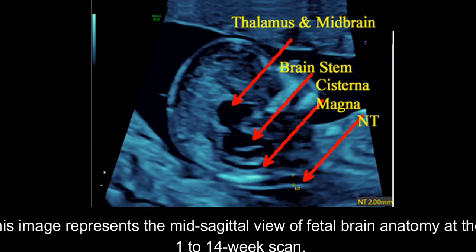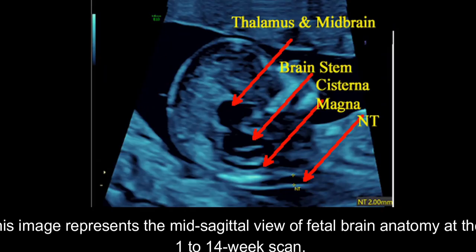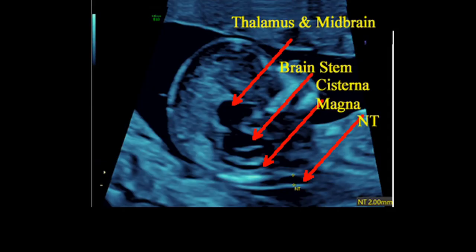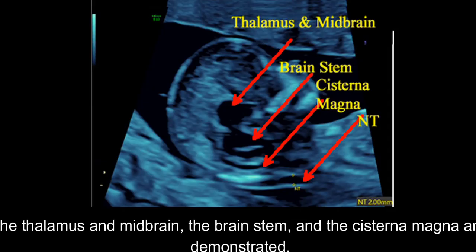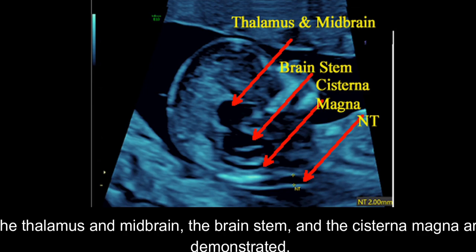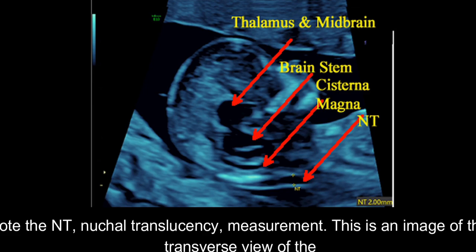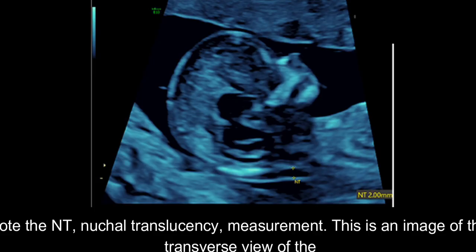This image represents the mid-sagittal view of fetal brain anatomy at the 11 to 14-week scan. The thalamus and midbrain, the brain stem, and the cisterna magna are demonstrated. Note the NT, nuchal translucency, measurement.